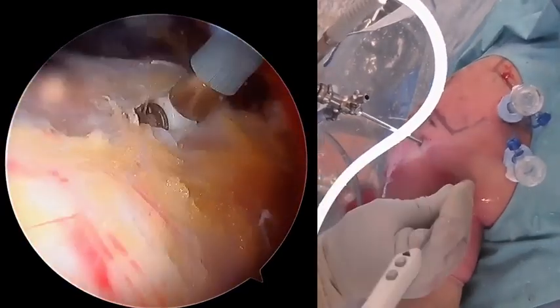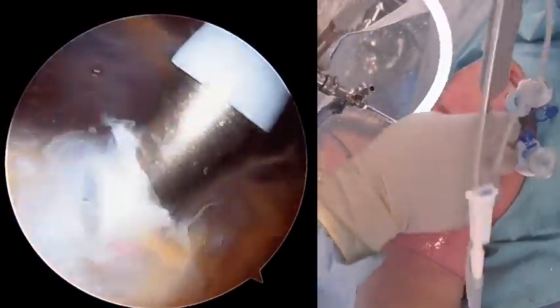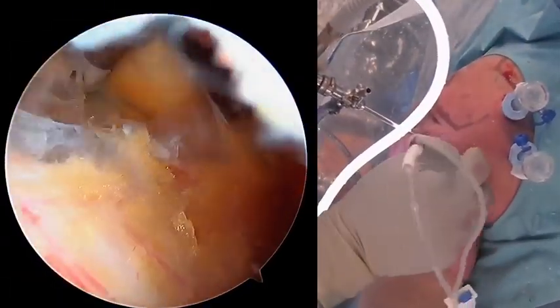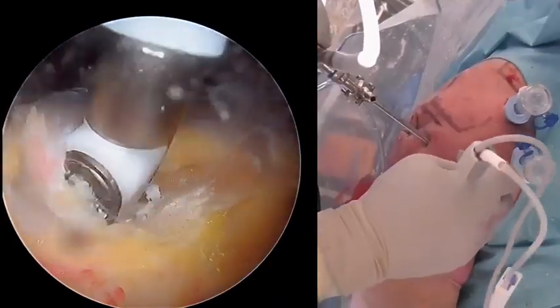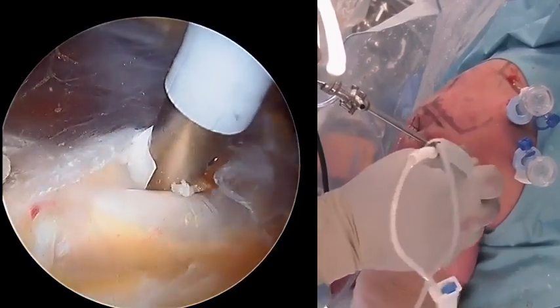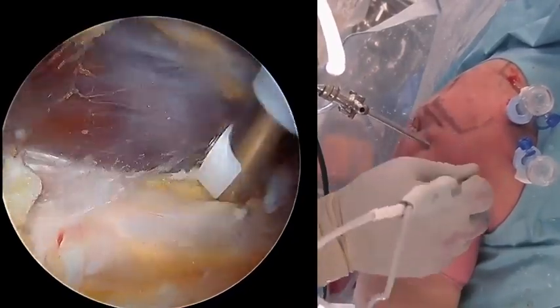We identify the biceps tendon sheath using the wave test and then bluntly open the sheath and confirm the biceps tendon is in the sheath. We then clear the space anterior to the biceps tendon so we can work with this.